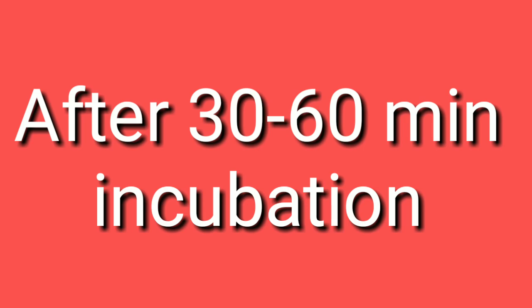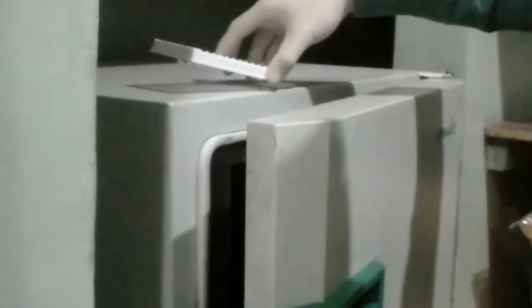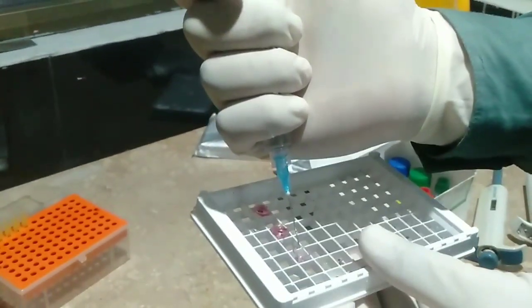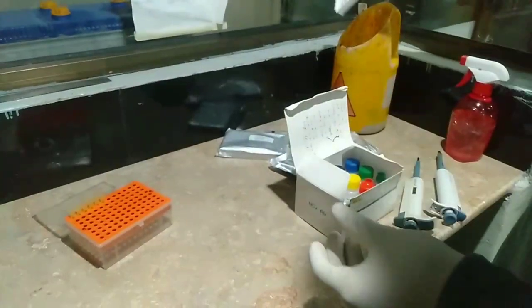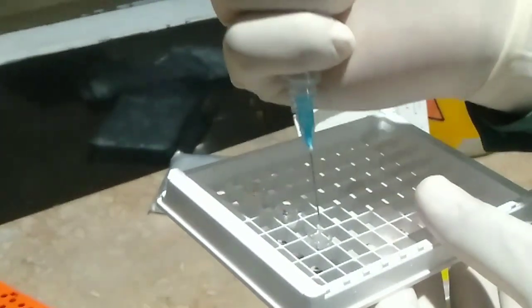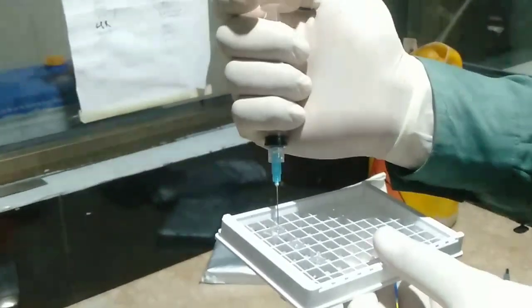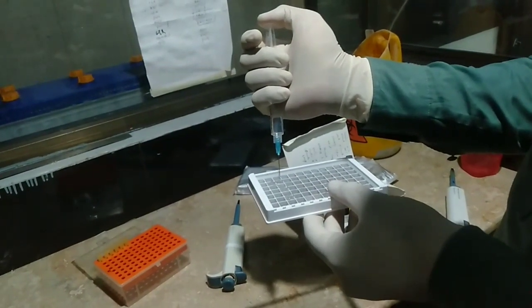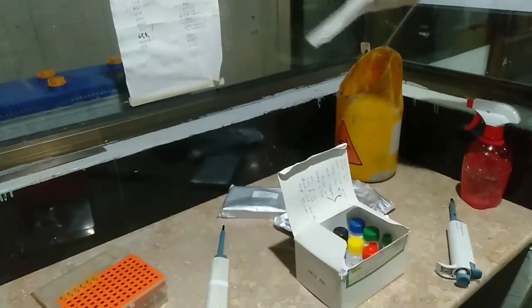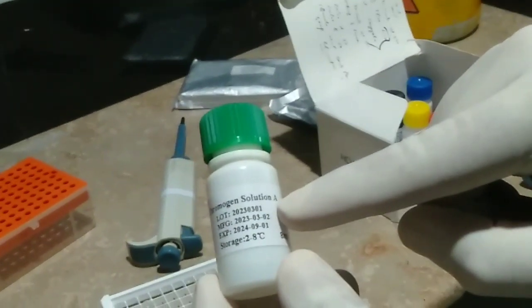After loading the conjugate, we keep the ELIZA plate in the incubator or at room temperature for 30 to 60 minutes. After incubation, we take out the plate and wash it again — three to five times. We fill each well, mix, and discard. This is the first wash, then the second wash, and then the third wash.